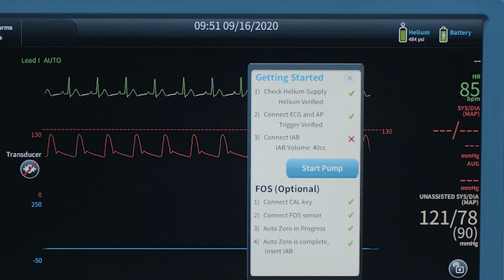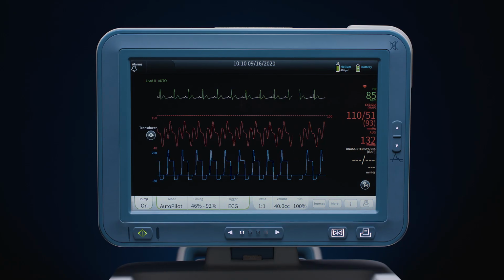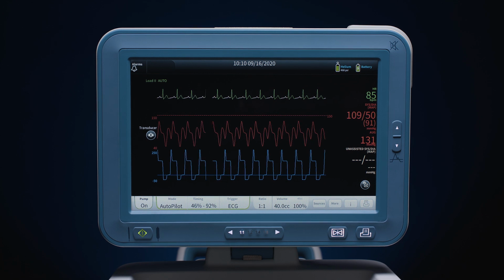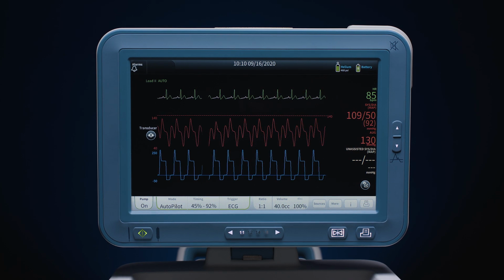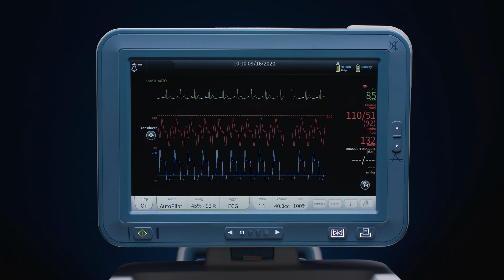a triggering signal. A standard pressurized arterial transducer setup will need to be prepared to connect to the central lumen of the balloon catheter and to the pump. Note, when using an Aero FiberOptix catheter, it is not necessary to zero the transducer setup prior to starting therapy. The AC3 Optimus IABP will automatically select and display the fiber optic arterial pressure waveform when initiating therapy.